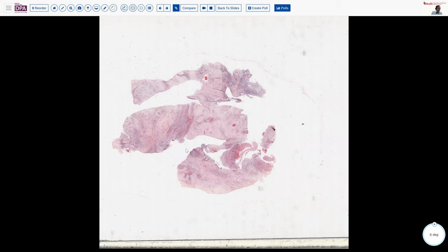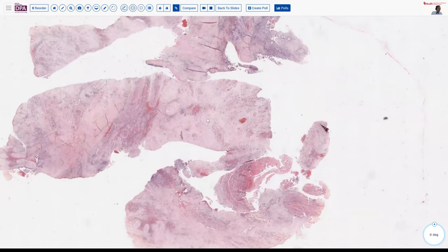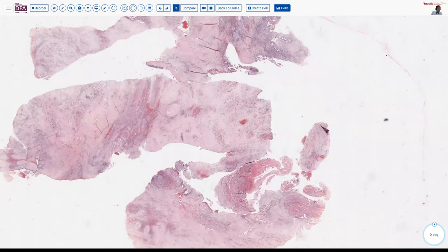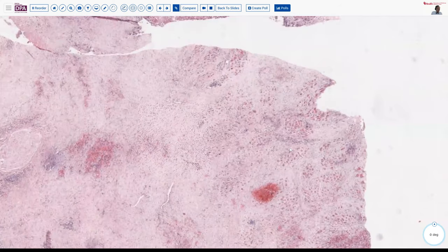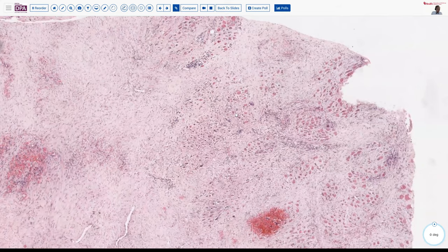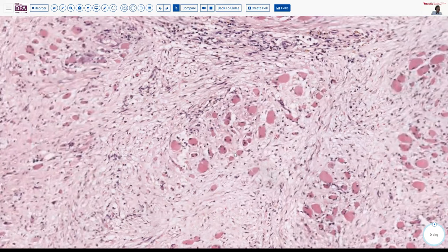So this is fragments of a soft tissue tumor in the proximal thigh in an adult. I know from presenting and sharing this case with my residents that there were a number of things that confused some of them. So I'll focus first on this area here, which shows these large cells with very pink cytoplasm, peripheral nuclei, and some degree of variability in size and shape.